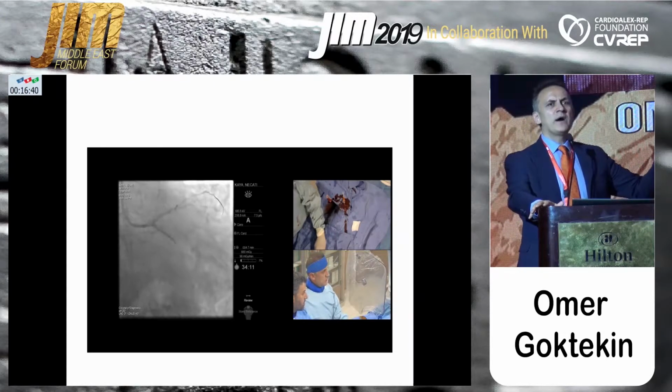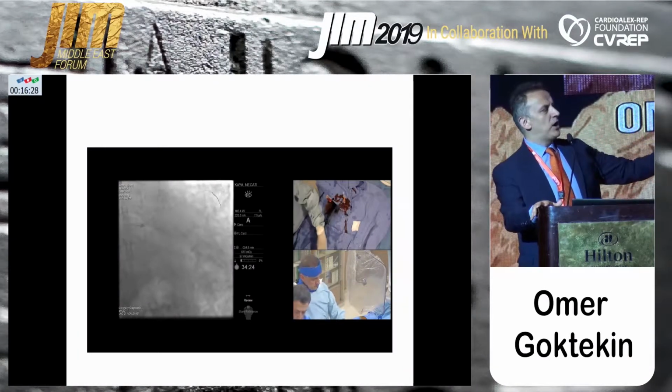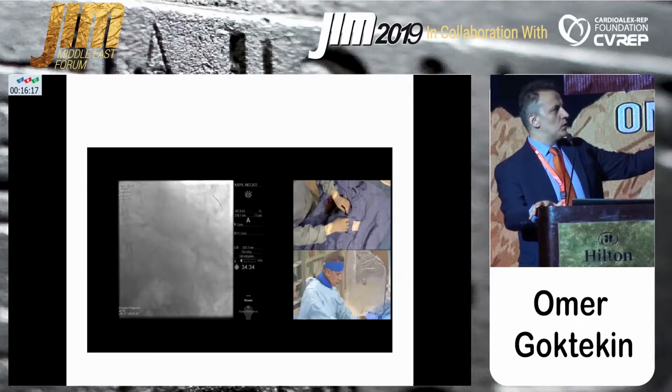You can use any wires, I mean Fielder XT, or you can use Sion Black, I think. Any hydrophilic wire could be tried. You see, I go with Pilot 50 until Pilot 50 stops. I didn't send any microcatheter because I don't want to do dissection with the Pilot.